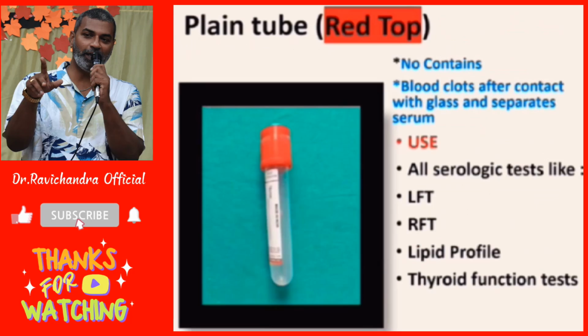Coming to the vacutainers, red top vacutainer, it has no anticoagulant. Blood clots after contact with the glass and separates serum. It is used in serological tests like LFT, liver function test, renal function test, lipid profile, and thyroid function test.